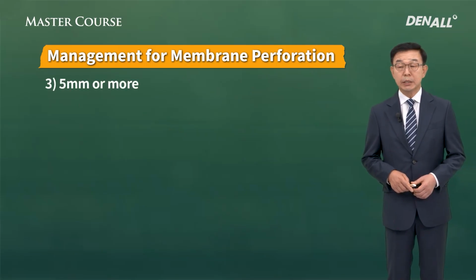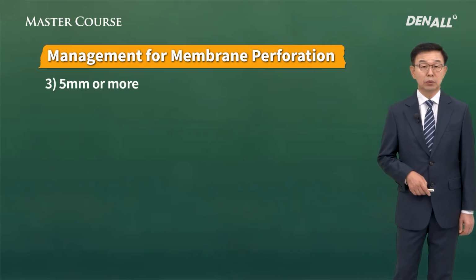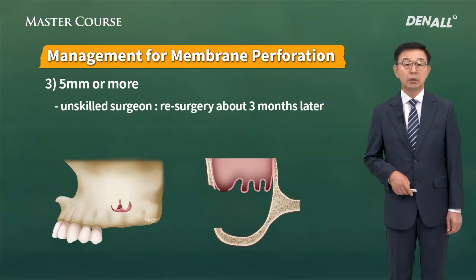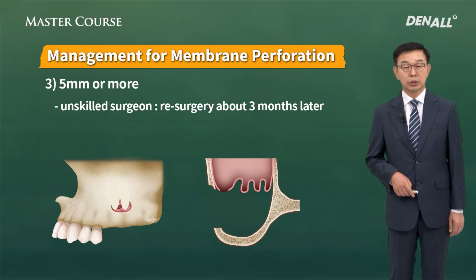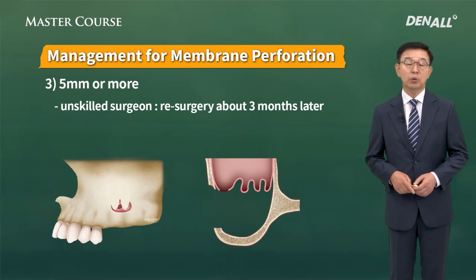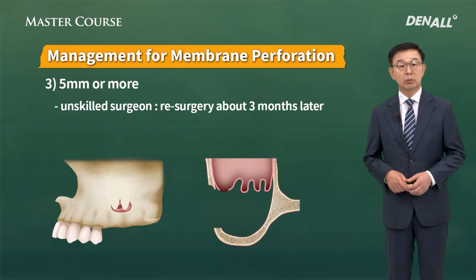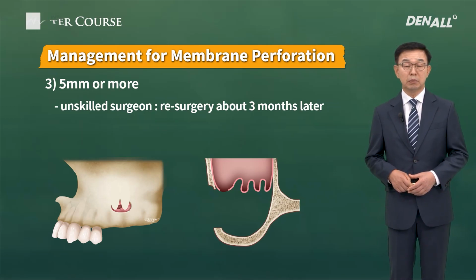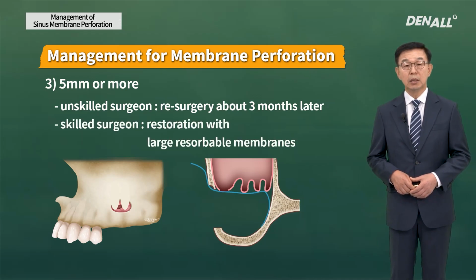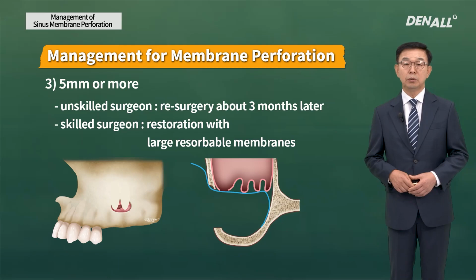Next, I'm going to talk about cases where sinus membrane tears over 5 millimeters. If you don't have a lot of experience, I suggest you end the surgery and wait 3 months. Wait for the sinus membrane to repair, and that'll be the best way to go. If you have a lot of experience, you can use a big resorbable membrane to cover the torn area and proceed with surgery.